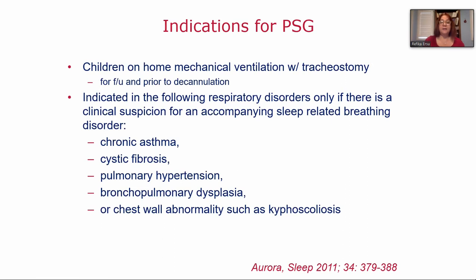And sometimes it's recommended to do a polysomnography by some papers prior to the decannulation of the tracheostomy. Some centers, again, just do gas exchange monitoring. There are some papers saying that you can miss some obstructive apneas if you just do gas exchange.